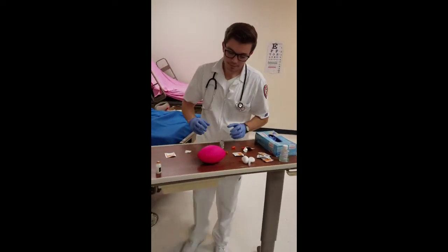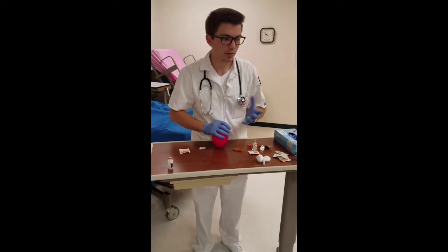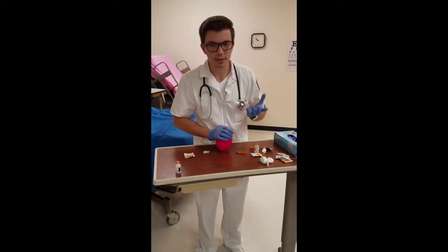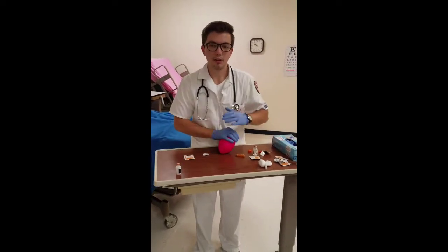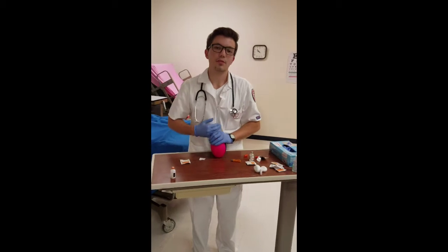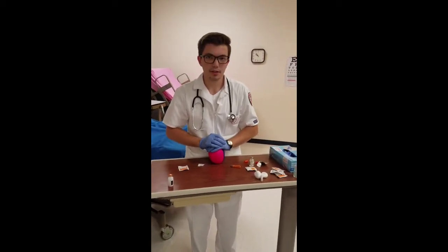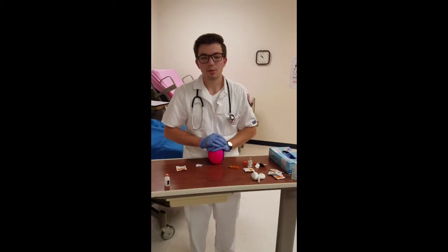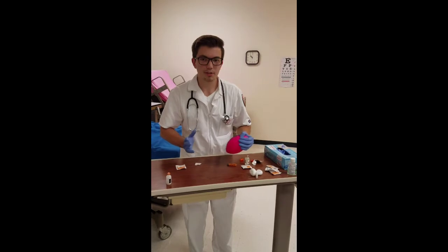And so now, for this I'm going to mention the different places that you would give insulin. You want to give it subcutaneously, so you could give it in the back of the arm, you could give it in the abdomen, as long as you make sure you rotate sites. You could give it in the anterior thigh. As for where you want to give it, as long as you rotate sites, usually it's patient preference is the biggest thing.